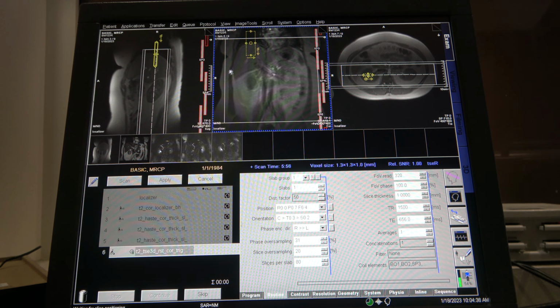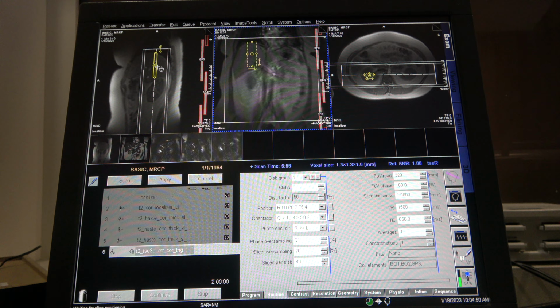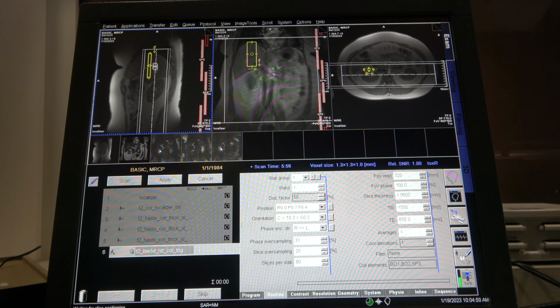All right, so you saw me move this around and you see how this sagittal is not solid. But if I move it, it turns solid. So now that this is solid, we want this one solid. So we're gonna move this one around and now both of them are solid. See that? And remember what I said? I like to put my ball on top of the liver.